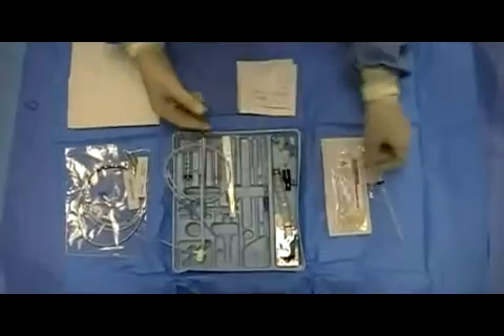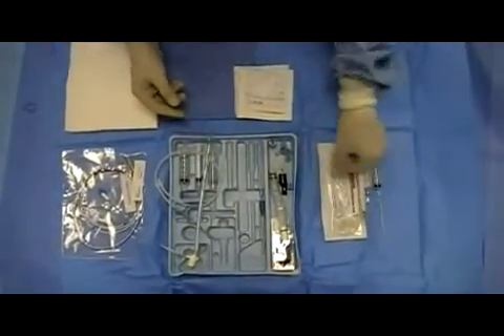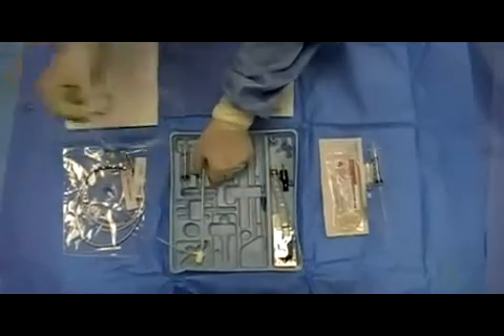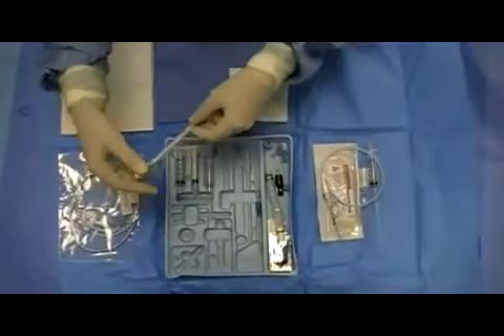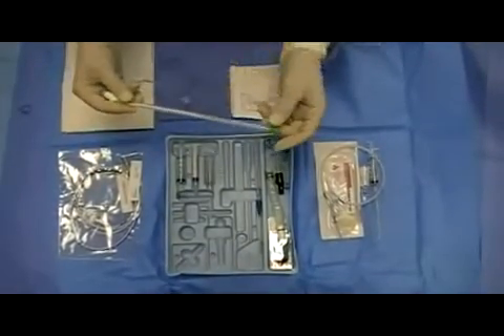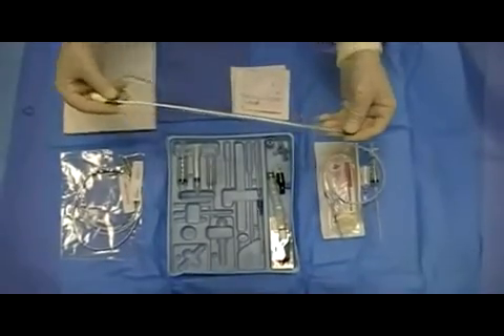Kit contents include a number 11 scalpel and a guide wire. Unique to the transvenous pacer kit is the cordis catheter, along with its dilator.